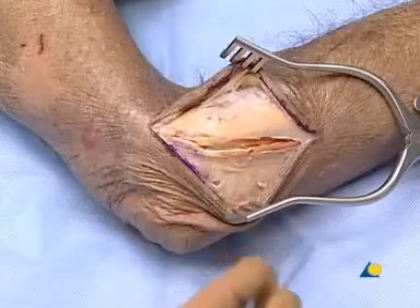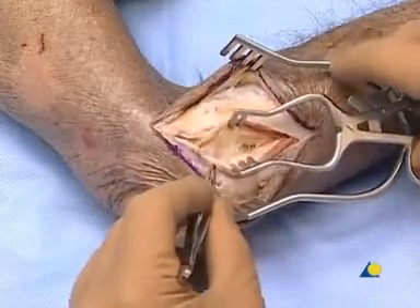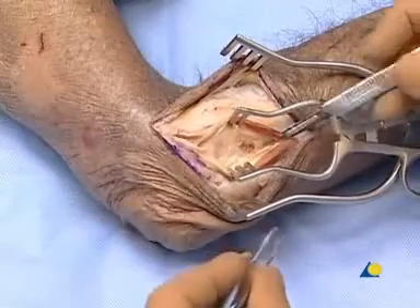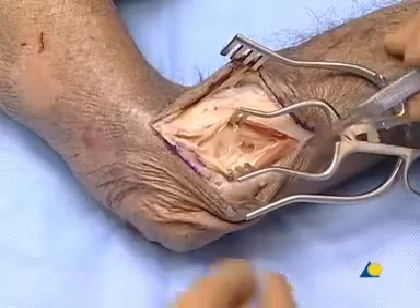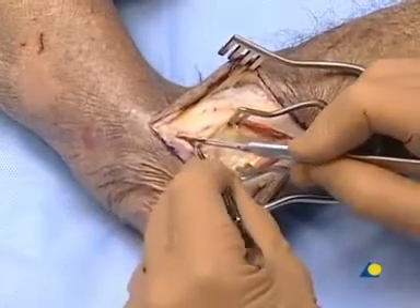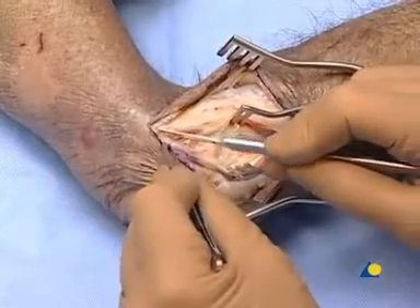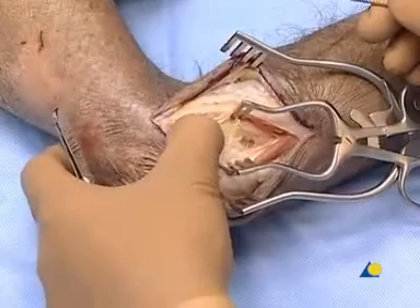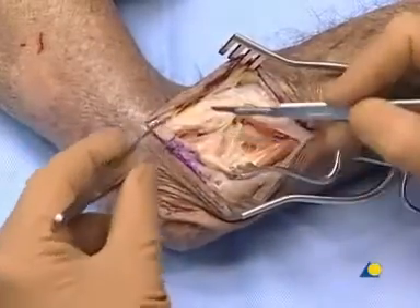Below is the supinator muscle, which should not be incised at this moment. The fibers of the supinator muscle are visible, running perpendicular to the extensor muscles. The dissection is extended proximally, and the radial head is palpated. The idea is to stay anterior to the equator of the radial head.